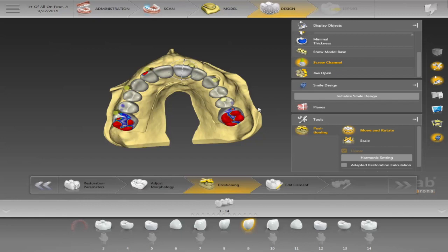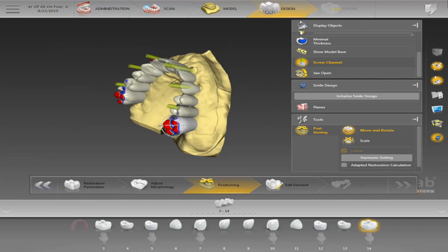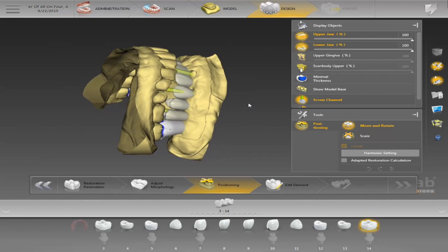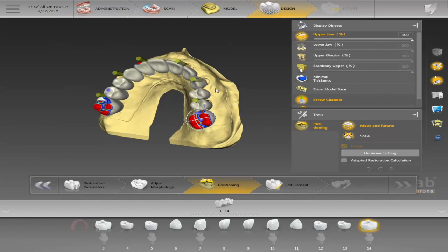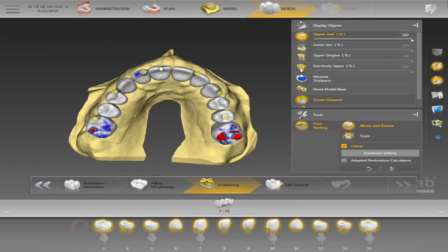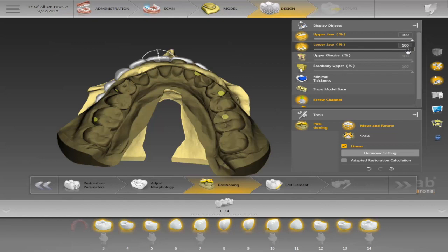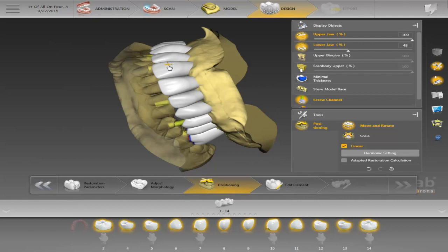Now we'll click on positioning, which allows us to position our arch into whatever position we want. We can also include the patient's picture and use smile design, but that's for another step-by-step. Once I bring out my lower arch, I'll click Control — Control+A groups them all — so when I click on linear I can move my arch as one piece. If I want to move them individually I also can, but for now I'll just set it into position in occlusion.